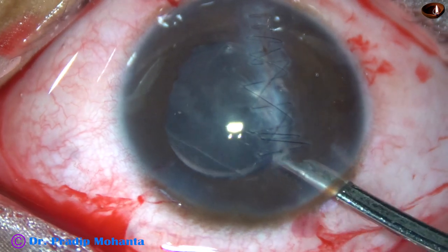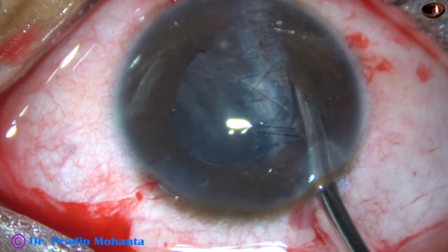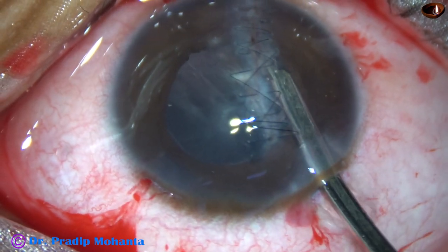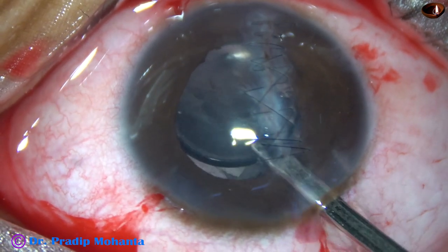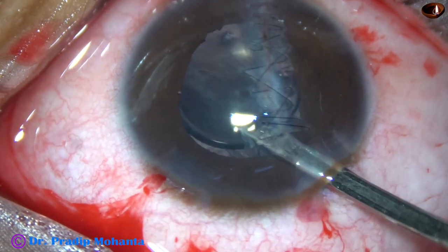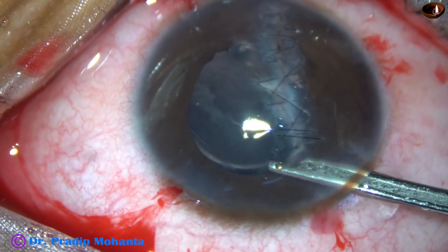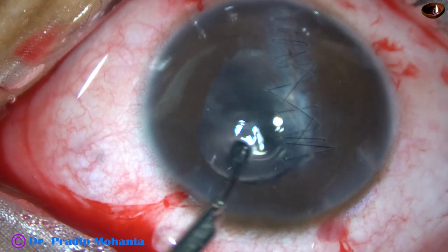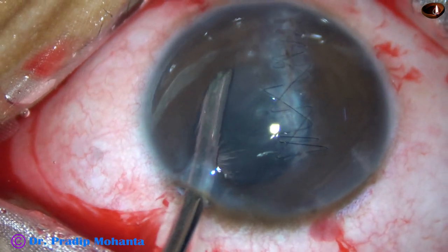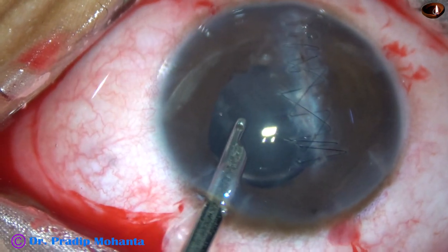This is an edited video, so I am just showing cleaning with the Simcoe cannula. After this, I cleaned with bimanual irrigation-aspiration. But with the Simcoe cannula, most of the visco — about 90% of the visco — came out. I went through the side port, went behind the IOL over the posterior capsule, then came anteriorly. I then went through the side port and cleaned some more visco, so almost all visco molecules have come out.